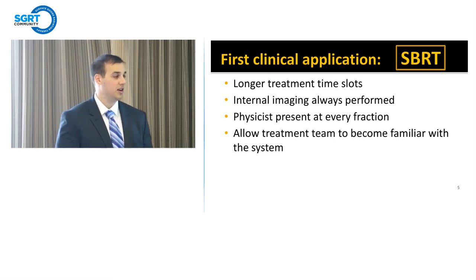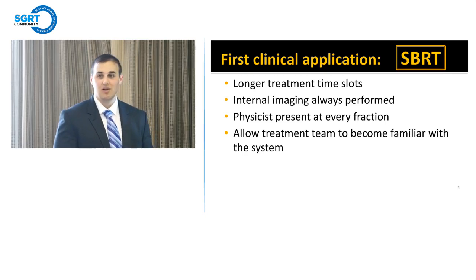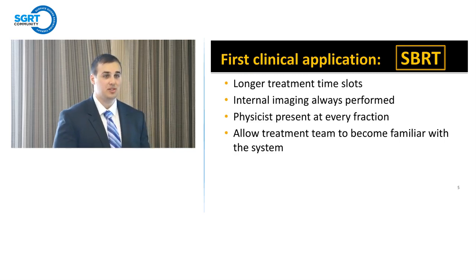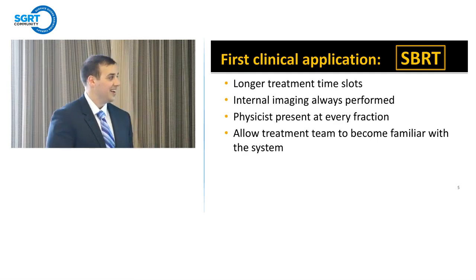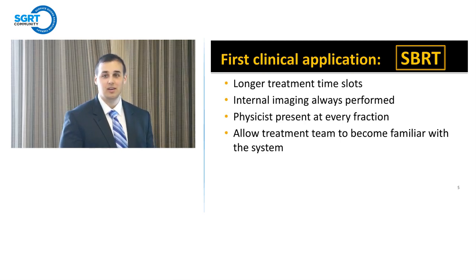And some reasons that we decided to go with that is the longer treatment time slots that are allocated for those treatments allow for more refinement of our process of this implementation. Similarly, as internal imaging is always performed, we have another metric in which we compare our AlignRT efficiency and setup. We do have physicists present at every fraction of SBRT, as well as the therapist there to treat, and then we do have a radiation oncologist for approval of the cone beam CT, and sometimes they're nice enough to stay around for a little bit. But so that allows us all in the treatment team to become familiar with it each and every fraction.